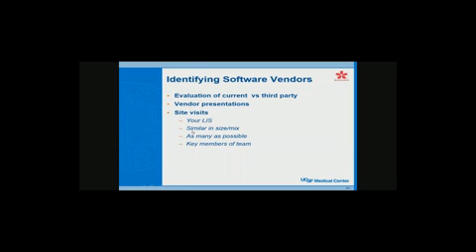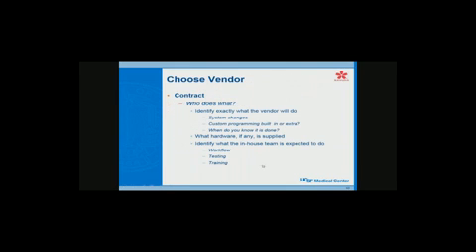and then key members of your team need to go. Your IT people, your administrator, the people who are on your implementation team need to go, your histology supervisor, key people that are going to work on this system to see what it looks like. Different people see different things when they look at a system. It's really good to get their viewpoint and see what sort of problems they see. But the site visits are really a huge part of this evaluation.